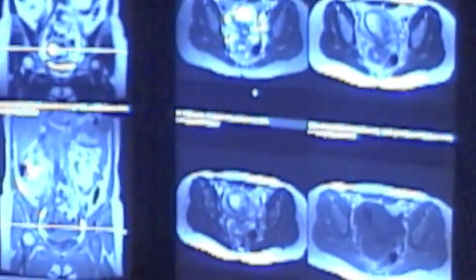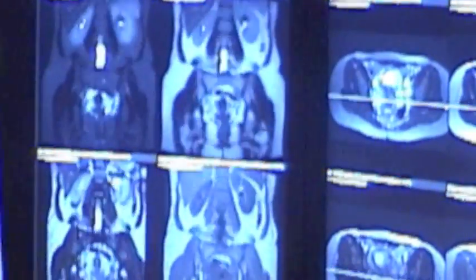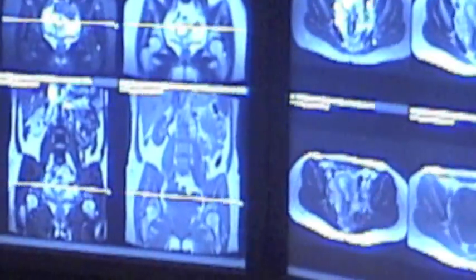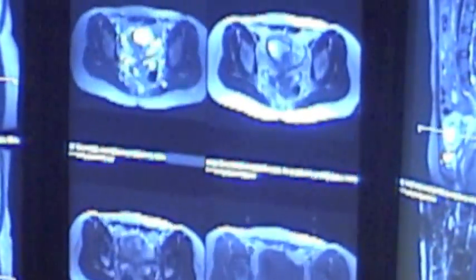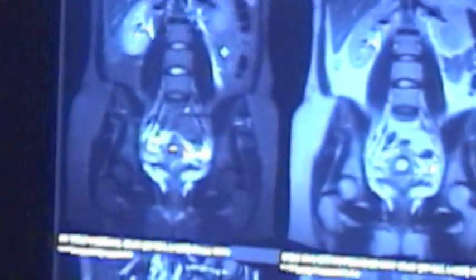Then I look for other causes of right lower quadrant or abdominal pain. The most common are ruptured cysts and fluid collections in the pelvis, easily diagnosed on axial images. Another very common cause is pyelonephritis or obstructive uropathy related to the patient's gestational status. You can look at the kidneys quickly and look for asymmetric signal to assess for pyelonephritis, which can be subsegmental or unilateral — very easy to see on T2-weighted images without and with fat suppression.